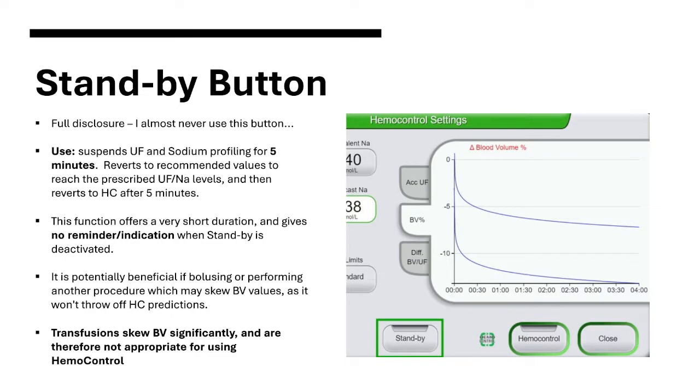So next up, I just want to briefly talk about this little guy, the standby button. So full disclosure, I almost never use this button. I don't think it's the best design in HemoControl, which is one of the reasons that I don't typically utilize it, but I'm going to explain the intended use for it.